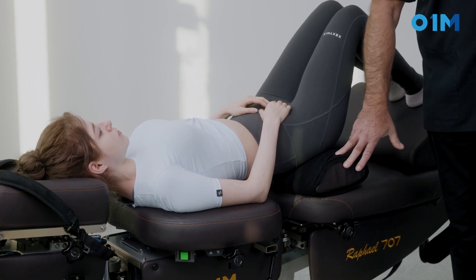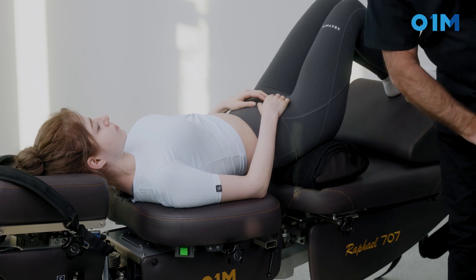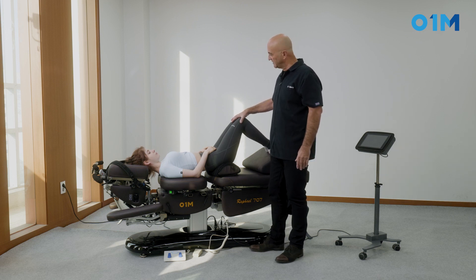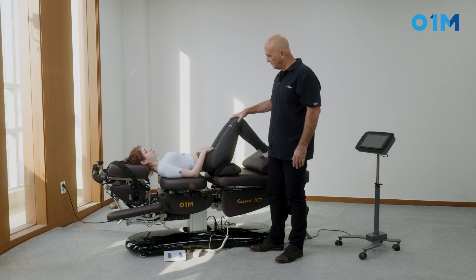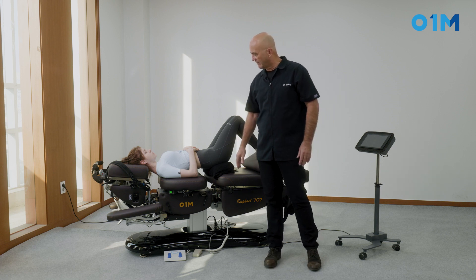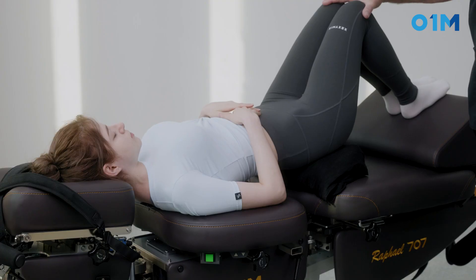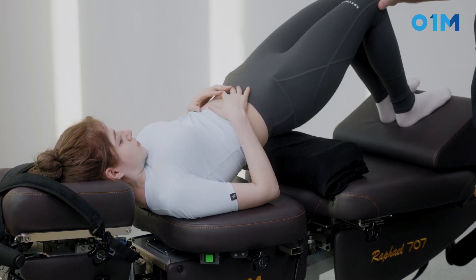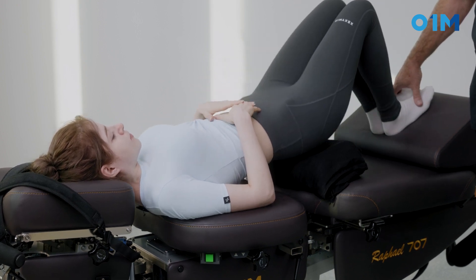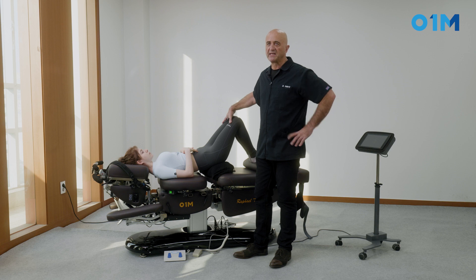Now if you have an automatic drop, we're going to put that drop on automatic so there is a self-tuning effect. We'll tighten the drop a little bit and now she can do that corrective move by herself — bring your pelvis up, drop it a little harder. With the auto setting selected, we ask the patient to on her own bring her pelvis up and drop it. It will be basically self-corrective for the patient, and the advantage is you don't have to intervene.